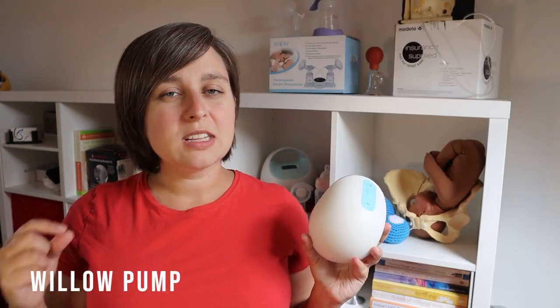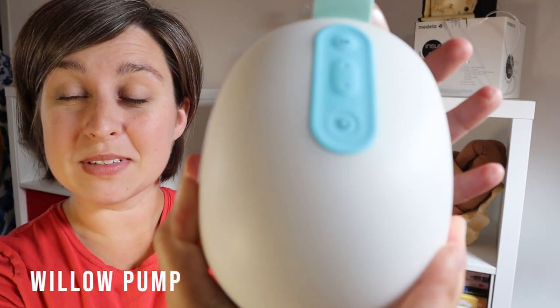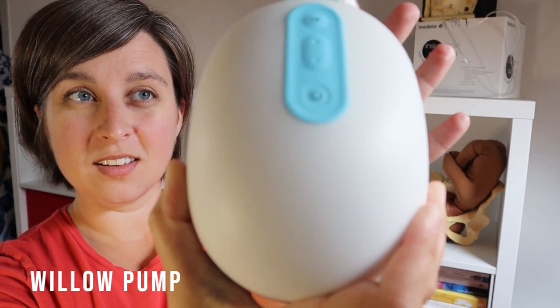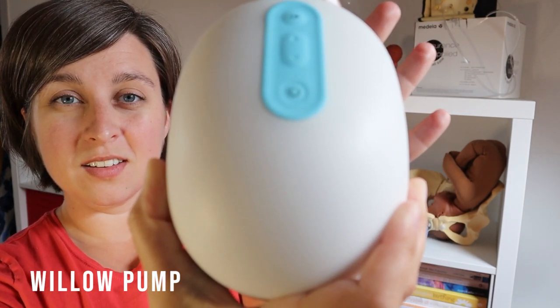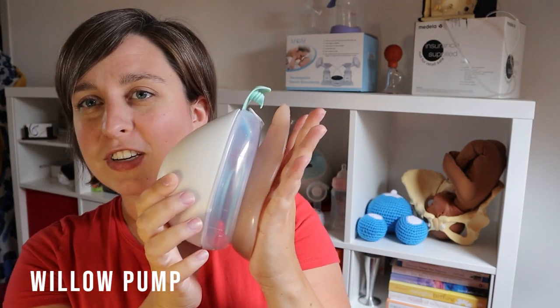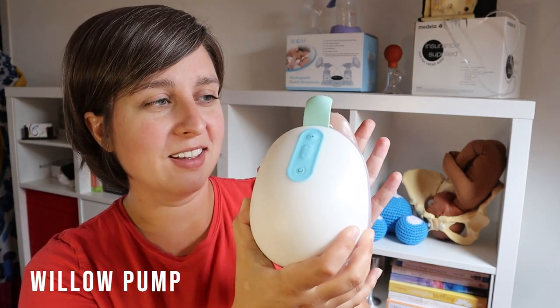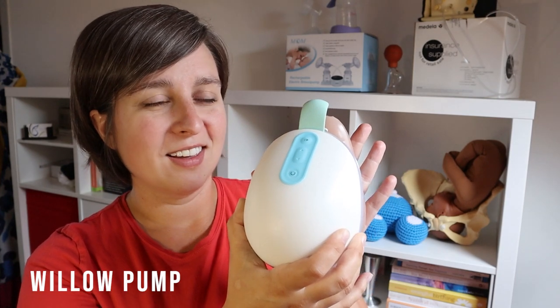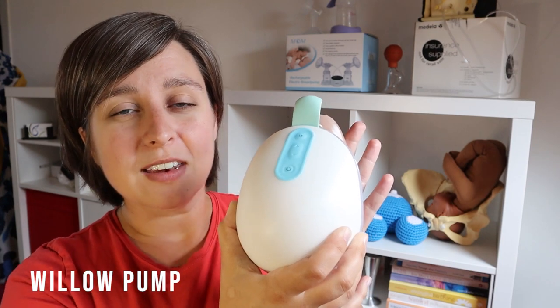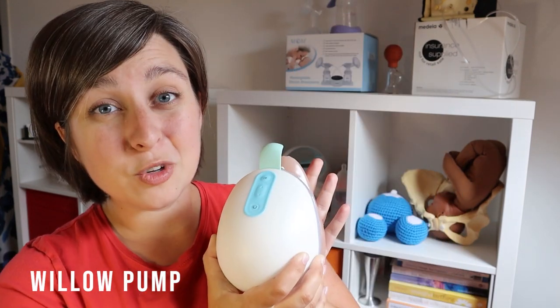The Willow also has an automatic switch from letdown to expression mode, which is really cool. This pump is going to require just a little bit of learning — it's different than your traditional pumps. It's actually pretty quiet as well, and it won't work unless the suction is right. Sometimes it makes a little extra noise when it's trying to find suction, which is a little bit louder than the typical suction sound.